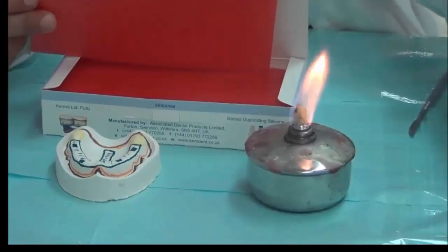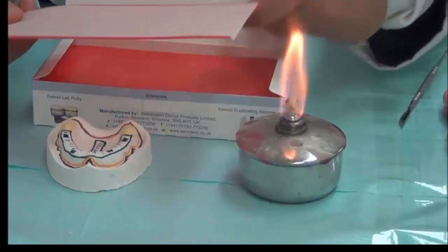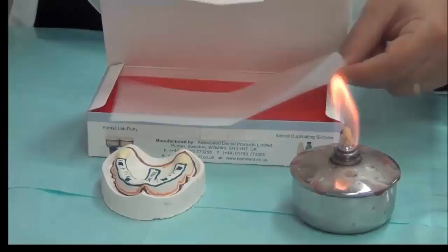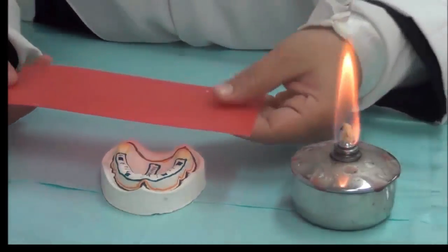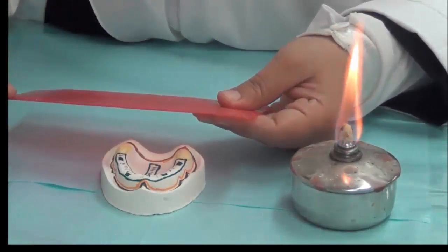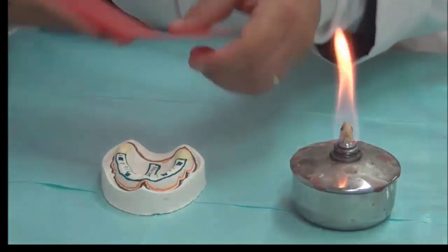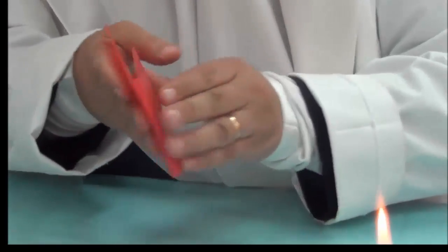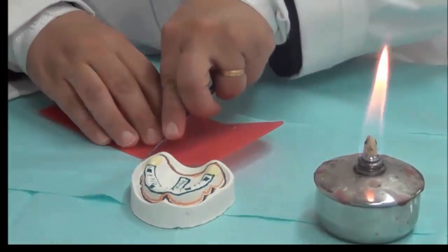To make the partial relief wax, we're going to use a wax that has a known thickness. Base plate wax comes in boxes, and it's usually pink or red. This wax has a uniform thickness of 1.3 to 1.5 millimeters. So we're going to use this as our spacer. We're going to do one for the upper, so we're going to cut enough material for the upper only.